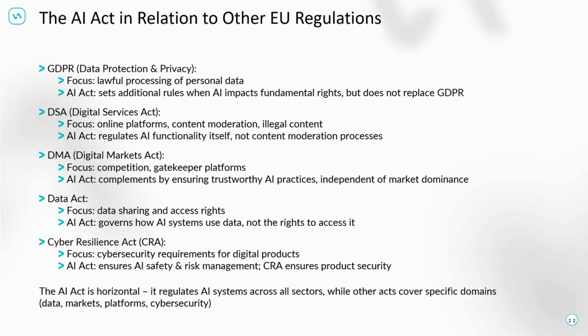However, it is done in a lot of spaces in addition with other regulations from the AI Act's perspective. Luckily, not for us, but for others who don't have a medical device, it is more intense. So the idea behind this, you can look for and you can decide now, do you want to have the focus on the AI or on the medical device?